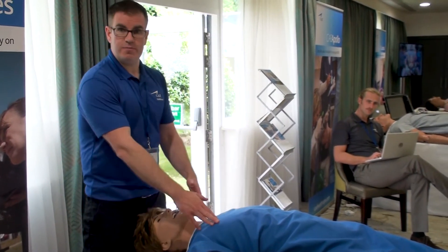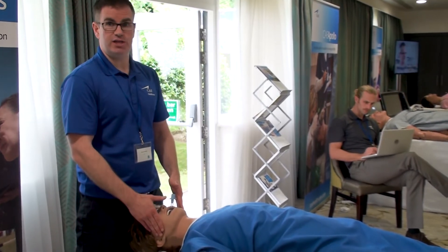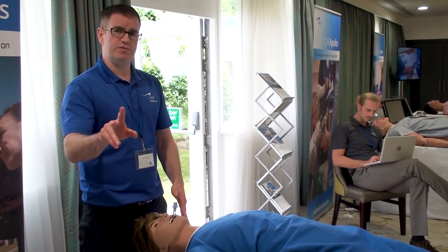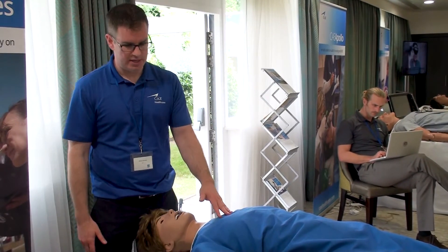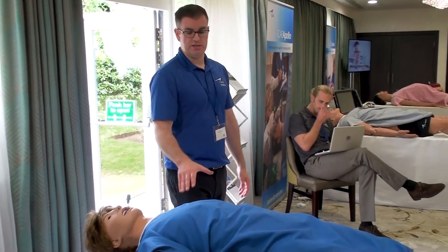We have heart sounds, lung sounds, and bowel sounds. We can defibrillate the mannequin, pace the mannequin, and do a 3-lead ECG on this mannequin. There are also two unique features specific to ARIES regarding sounds.